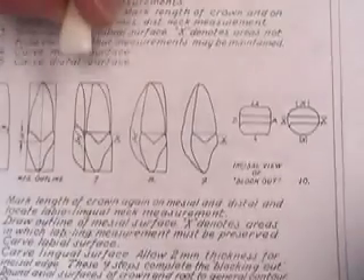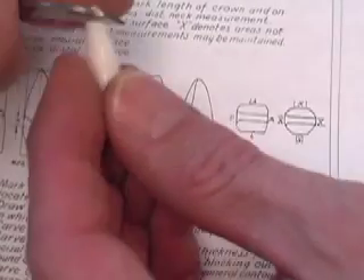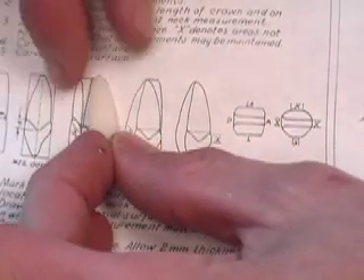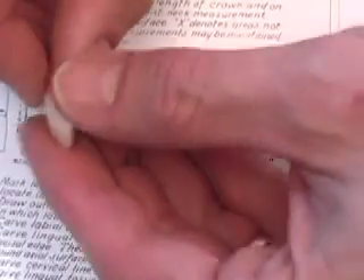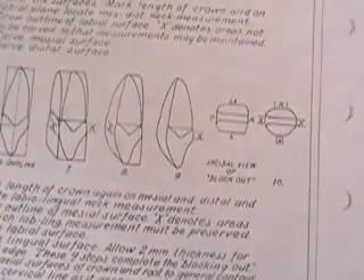That looks pretty close. I'm going to bring it over to the side view — same thing, looking for the smallest discrepancies. Looking right here on this concavity. Looks like the root hooks towards the facial just a little bit, so we'll take just a little bit off there. Looks like I've got just a little bit of excess bulge right there on the facial, so we'll take just a little bit right there. We are ready to proceed with the anatomy portion of this crown.